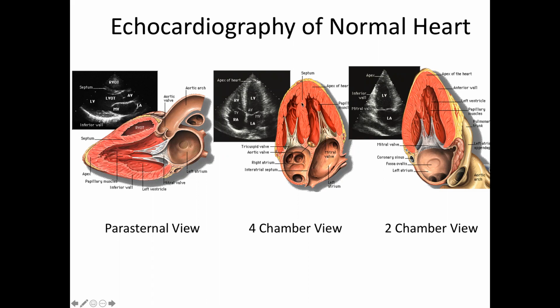If you want to look at the orthogonal view, we've got all of this heart wall now imaged, but I don't know what's happening out of the plane. So I just rotate by 90 degrees, and if I intersect this volume, I look at this picture. Actually, you intersect it sort of here. It cuts through the left atrium and the central part of the left ventricle. Here you see this, and then there's the left atrium. So you move around.